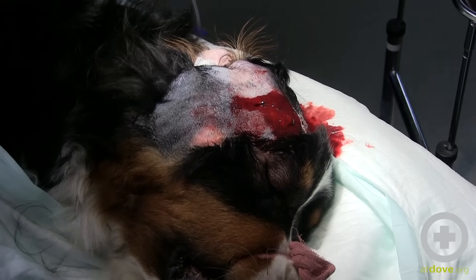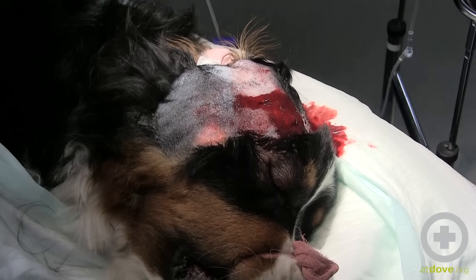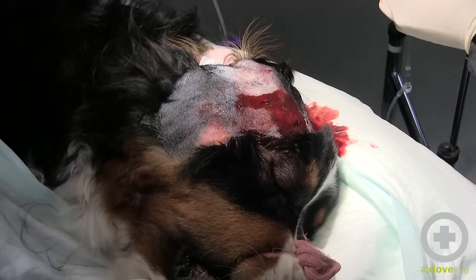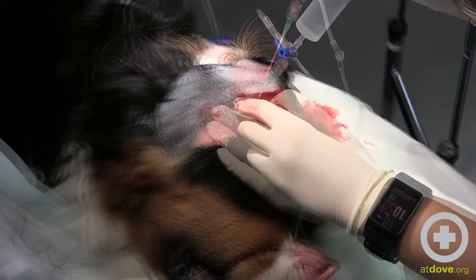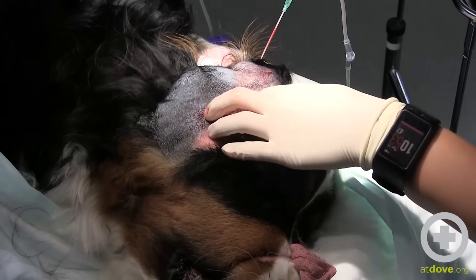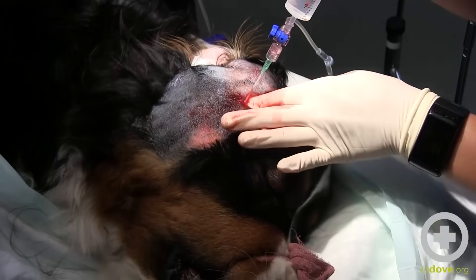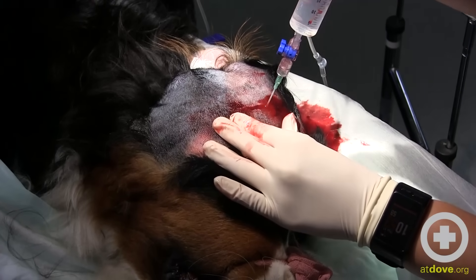We're going to get some flush in there. Sometimes it takes a really long time to flush these out — when the pocket is this big you may be here for 15 or 20 minutes getting it lavaged out. There is a decent amount of hemorrhage, but I'm not too concerned about that. There are certainly areas where it's bleeding from the skin and probably some of the underlying smaller blood vessels — that's to be expected.